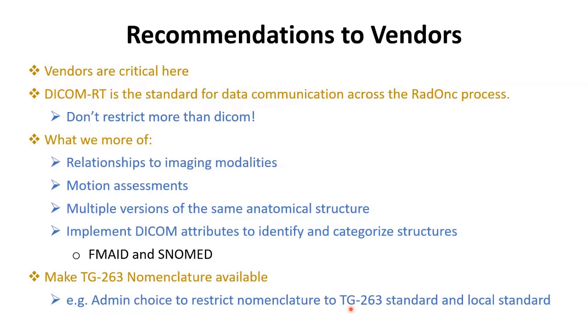And also, I have a question. Sometimes doctors will ask to control two PTVs. Let's say they have PTV 70 gray and PTV 66 gray. They want to have two plans with those PTVs, and then they will decide which one they will go ahead with for the treatment. So which one is good practice: to have both PTVs in the same structure set or in different structure sets?